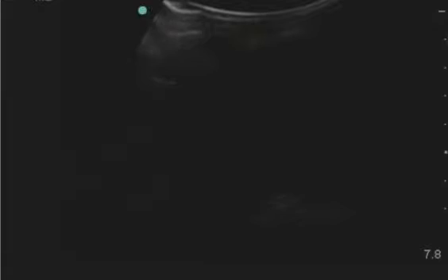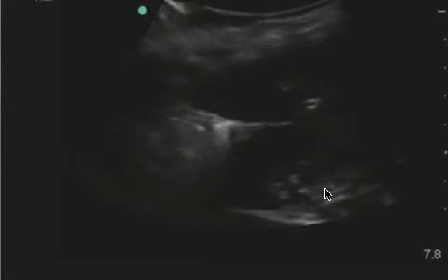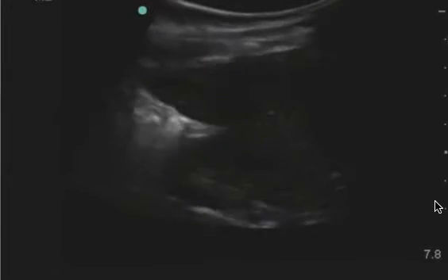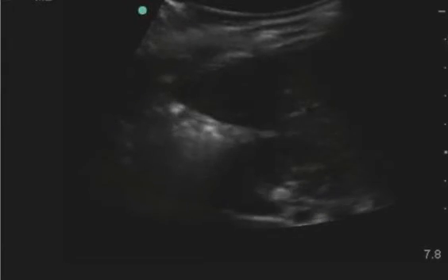This is the right upper quadrant, and I agree this is limited for a couple of reasons. First, it's way too undergained. Second, your probe is backwards — your indicator is to the patient's feet. And finally, you have to increase the depth a little bit because even though you can see the liver tip, you don't see the base of Morrison's pouch. You don't see the spine. You don't see the diaphragm. So this is indeed limited.